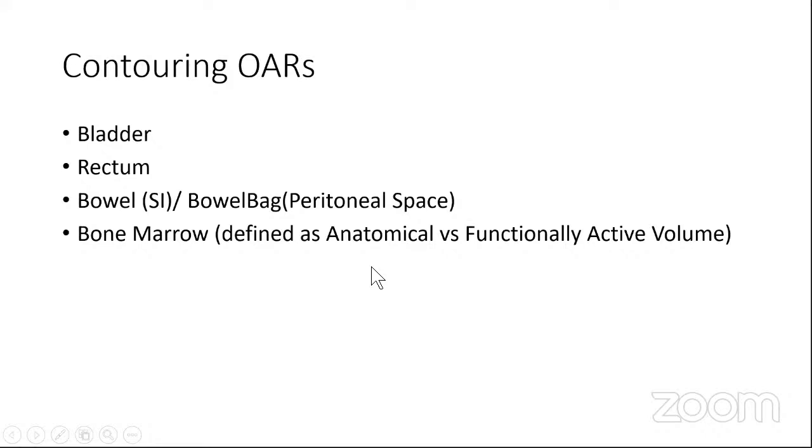So then going ahead, once we have done imaging, right on the day of the simulation scan, ensure that the rectum is not abnormally distended. Again, the bladder is not excessively distended. All those things you can check. If there is more than 4 centimeter of gas in the rectum, we deflate it and redo the scan, or we call the patient after another day after a good laxative treatment. All right.